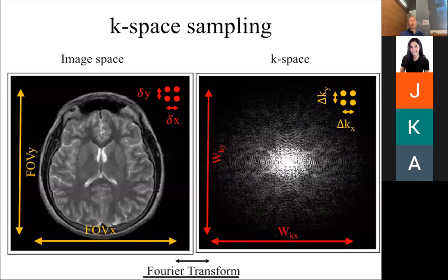Okay, any questions before we move on? Yes? What's the limit to how fast the gradients can switch? That's a good question. Every gradient is specified with two things. You saw a little bit about that. In one of the problem sets, we put a limitation on how big the gradient can be. I was nice to you this year. I didn't put a limit on how quickly it could change. That would change the problem a little more.